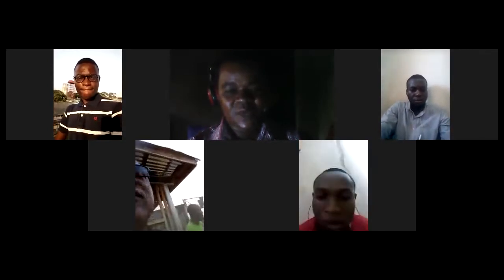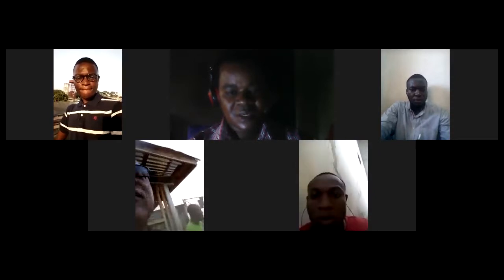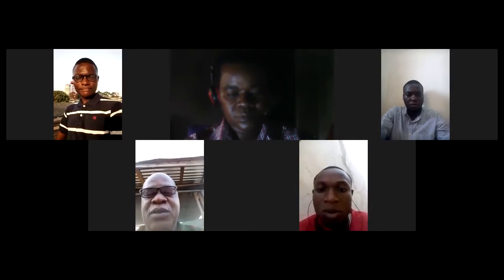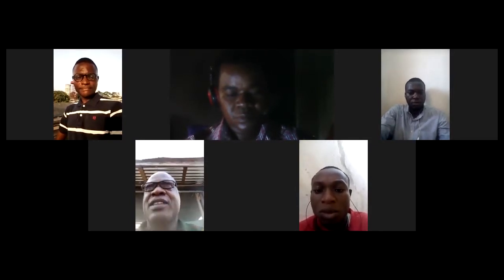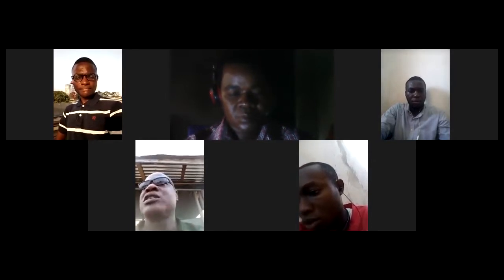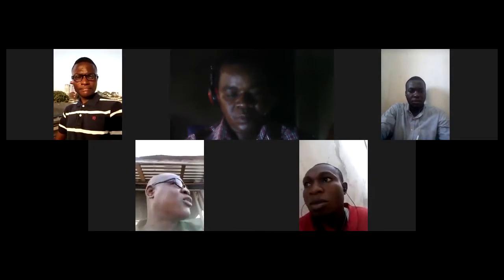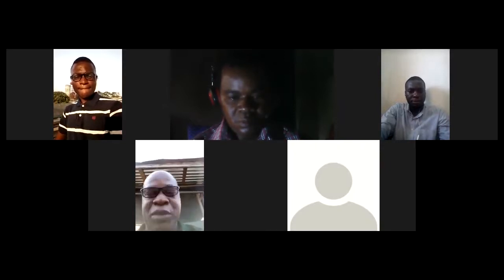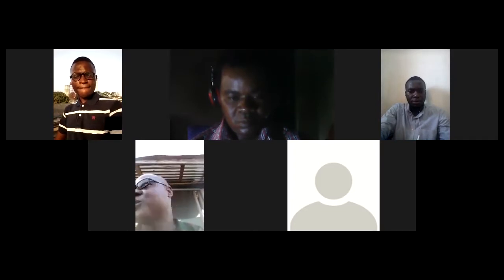Anyway, my contribution will be short. What I can just contribute is that, yes, impression is brought from the clinic. First of all, moderate running tap, to remove the blood stain deposits that may be contained in the impression.